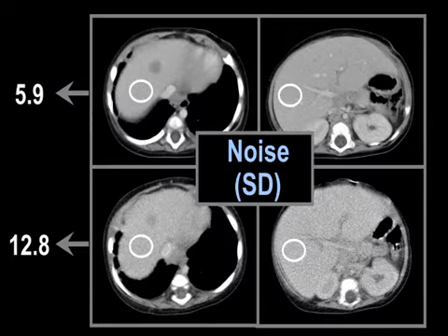But when you look at children, and this is the same patient scanned 2 different times, immunocompromised, possible infections in the liver, microabscesses, something that we probably need to use a little higher dose to do, and 2 different times we scanned, one at a noisier technique, less radiation, and one at a greater radiation dose. And you can see this lesion quite well in both, but boy, this one is sort of lost. I mean, it's kind of right there, but this is something that's going to be more challenging to see.